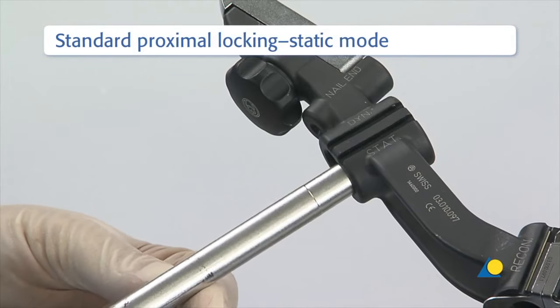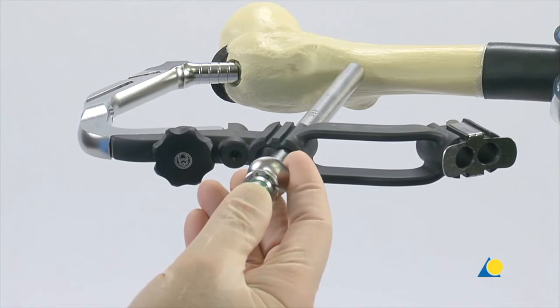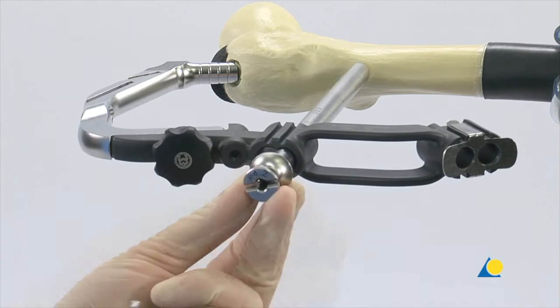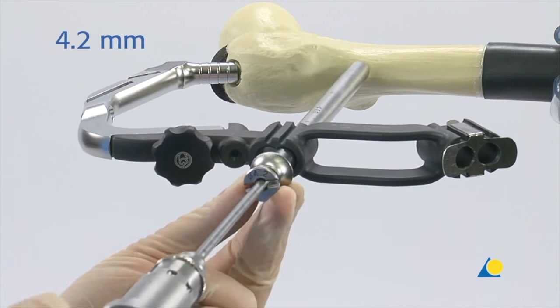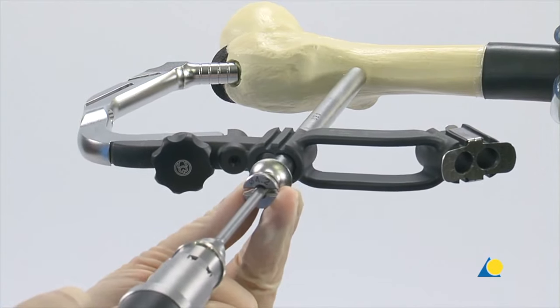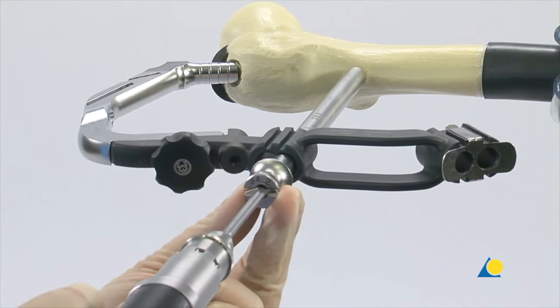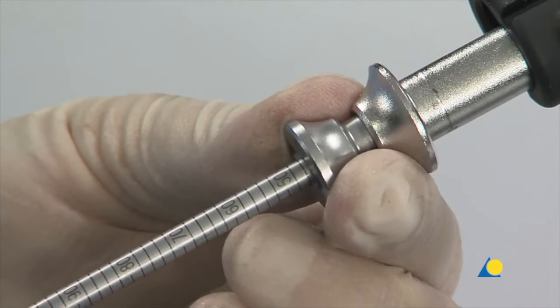A stab incision is made down to the bone and the 3-part trocar combination is inserted through the green colour-coded hole in the aiming arm labelled STAT. The trocar is removed. The 4.2mm calibrated drill bit is used to drill through both cortices until the tip of the drill bit just penetrates the far cortex. The position of the drill bit is confirmed with the image intensifier. With the drill sleeve pressed firmly to the lateral cortex, the screw length is read from the calibrated drill bit. The drill bit and the drill sleeve are removed.